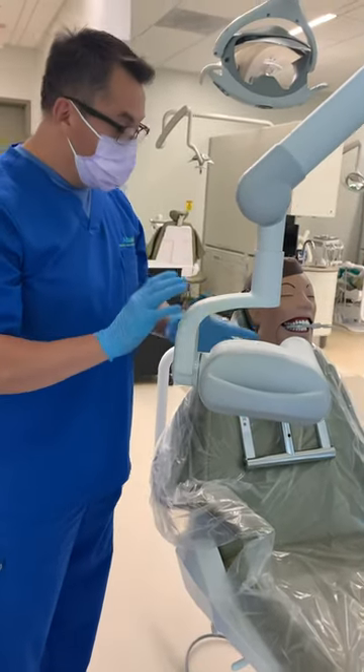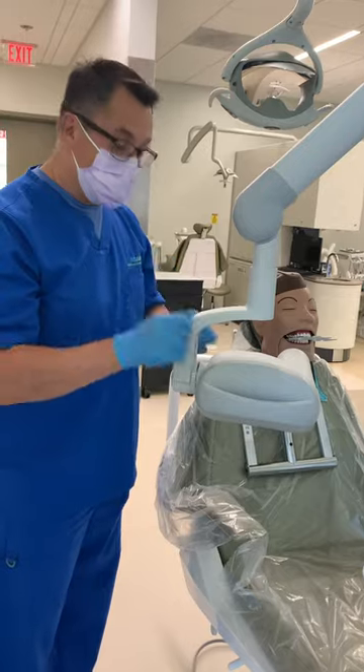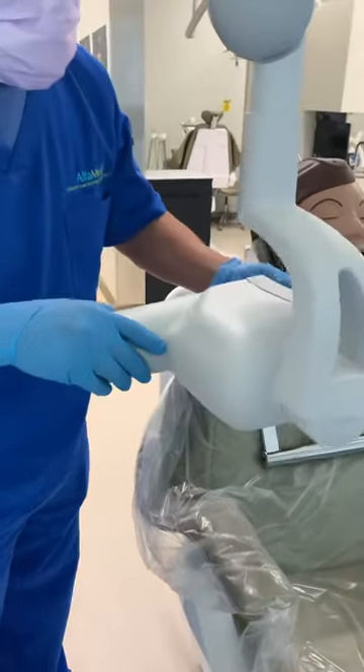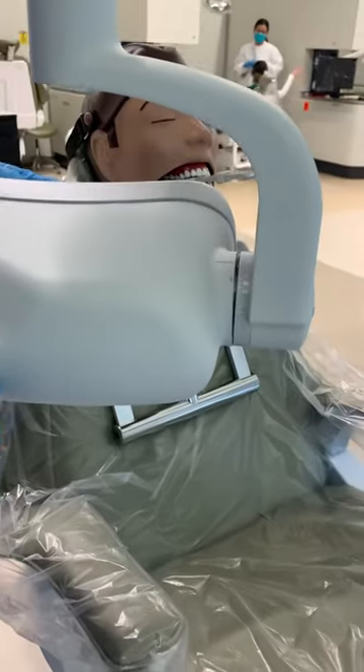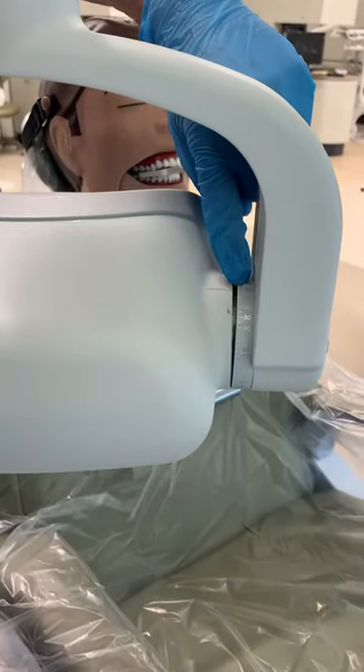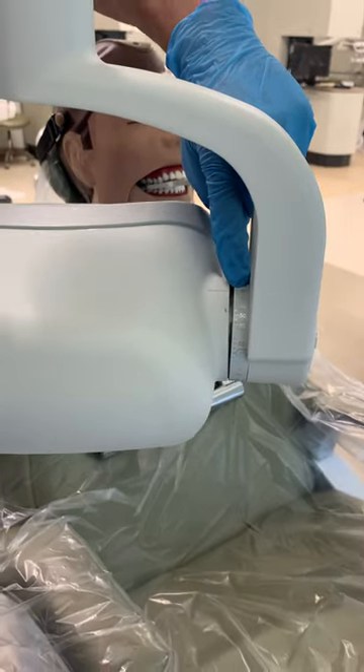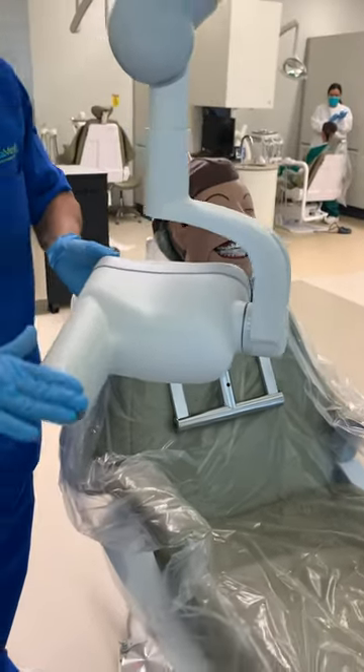Normally the books start with 20 degrees plus. That means when I set this up — if we get closer — to 20, right there. The line is actually marking the 20 degrees. That means the PID is going down.